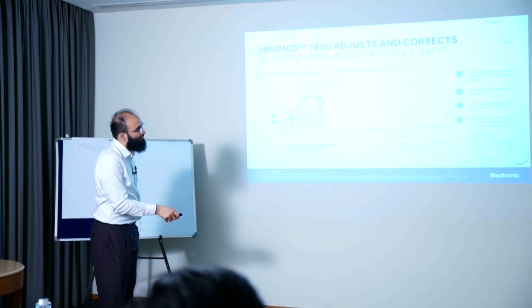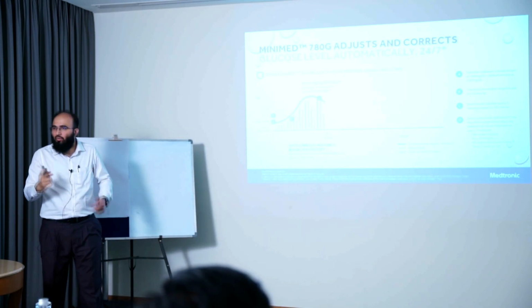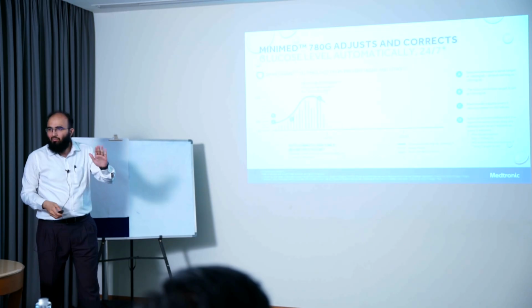No automatic corrections if temp target is set. I told you, right? Temporary target. He's going for exercise. 150 was set. No auto correction will be given, even if it is 150.